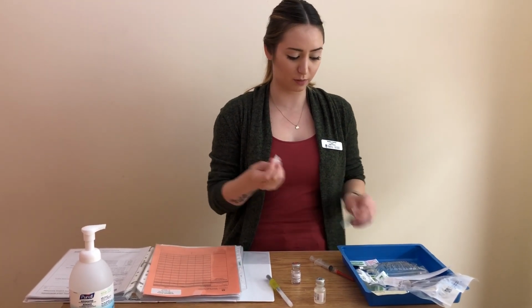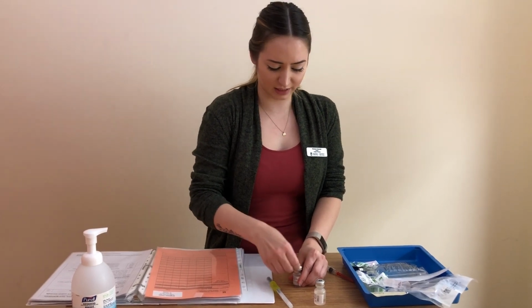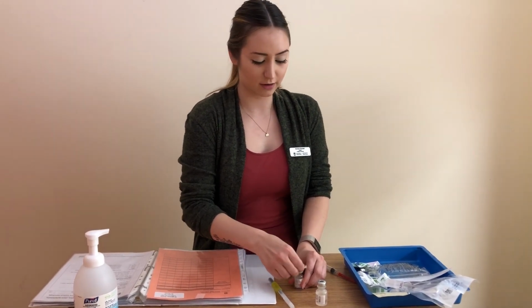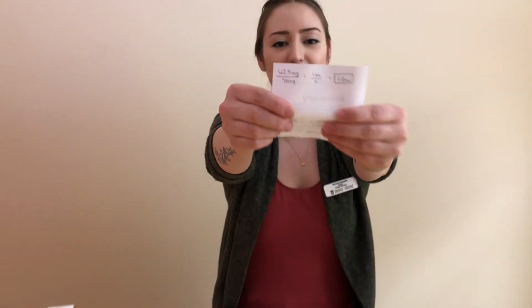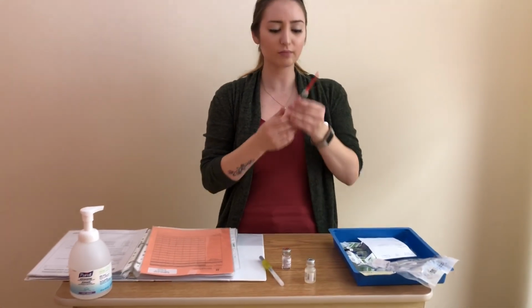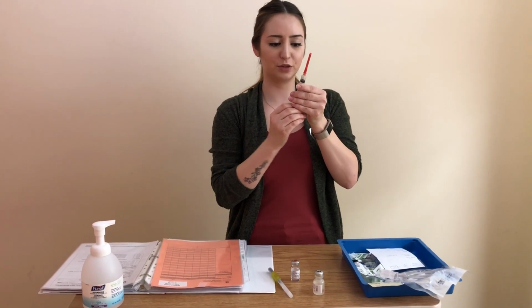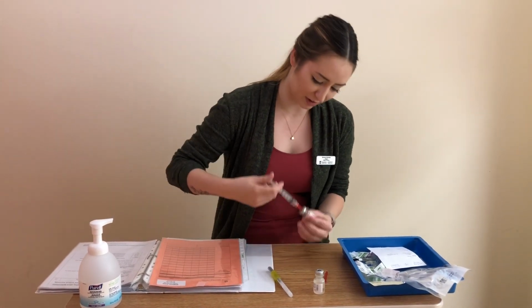Before I do that, I'm just going to swab the top again, just in case I touched it, just to be extra safe, for 30 seconds. Let it dry for 15. So for my calculations, I need to pull up 1.2 milliliters of the drug to get my dose of 75 milligrams. So 1.2 milliliters of air. I will inject it into my vial.